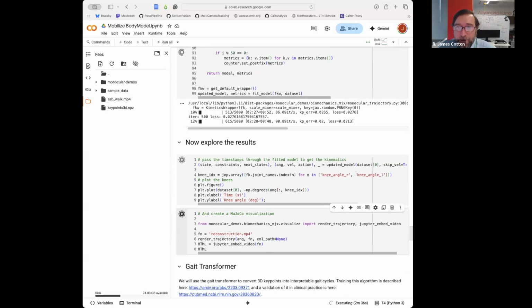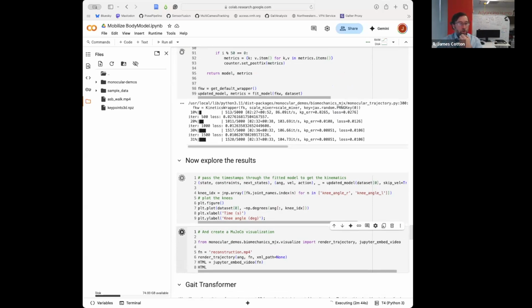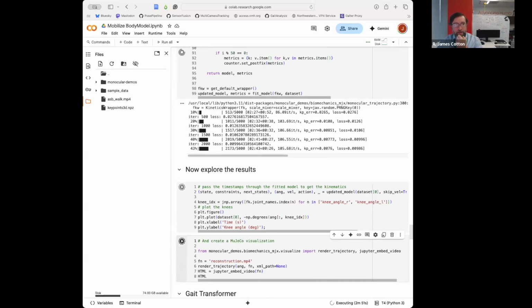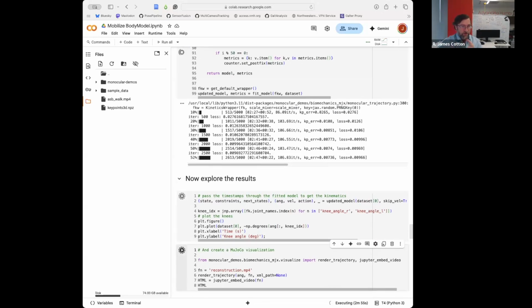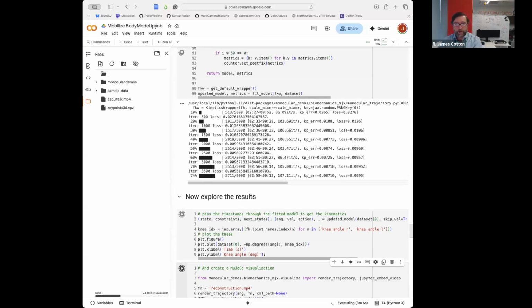Okay, in daily practice, what would be the average time required for the complete workflow? Well, as I said, we're kind of a volume lab. We've had days where we've done hundreds of trials, and the step of manually annotating is the one that requires someone to actually check the data, but otherwise the computer just sits and works on it for a couple of days. So it's not too bad in terms of human time per trial, if you know what I mean.